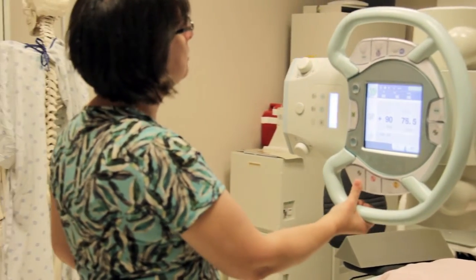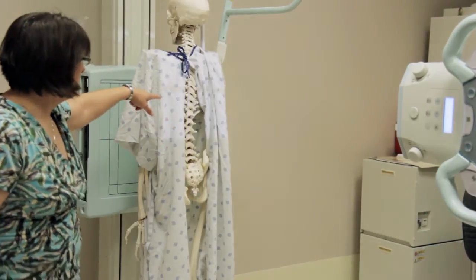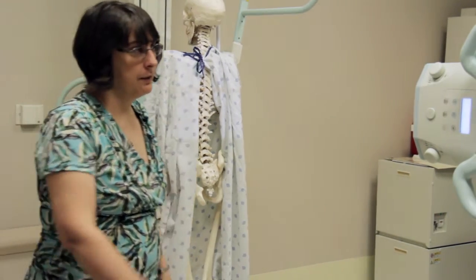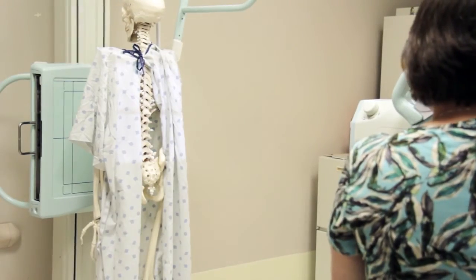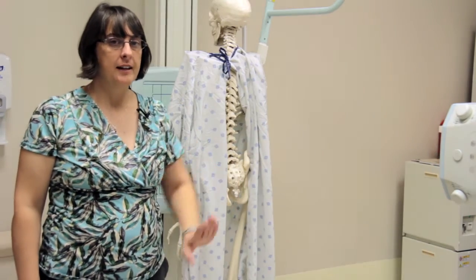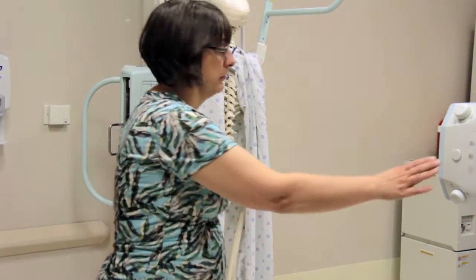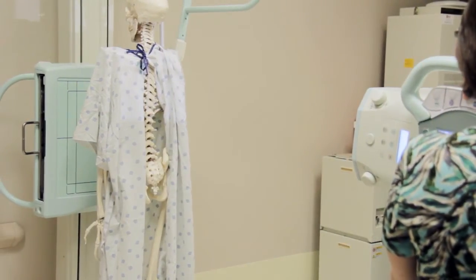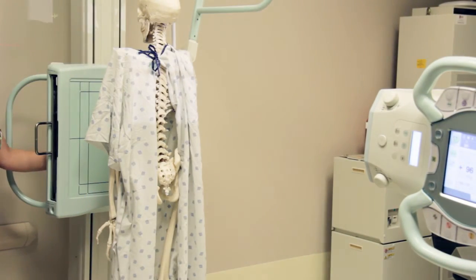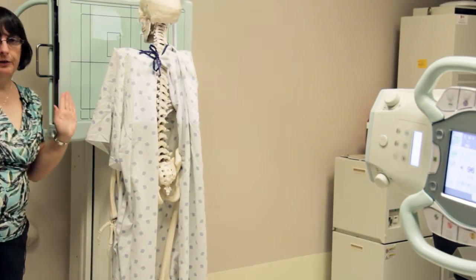Stitches are always done at 72 inches. What I'm going to do now is set up so the middle of my area is at the level of the BBs. Once I've determined that height, I'm going to leave my tube there — I'm not going to adjust the height at this point. I am only going to angle to make sure I'm covering the area I need to cover. So for this patient, I'm going to angle up until I make sure I have the base of the skull. Then I'm going to line up my Bucky so the two match, and now I'm ready for my first picture.